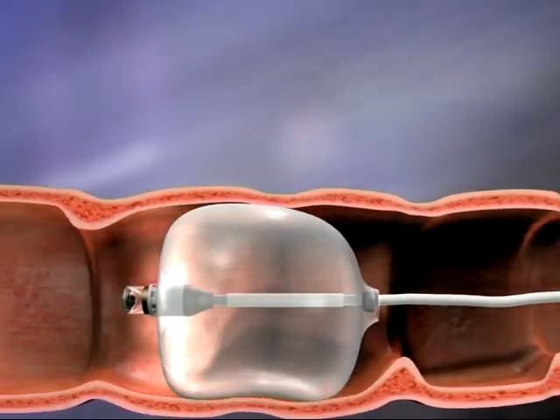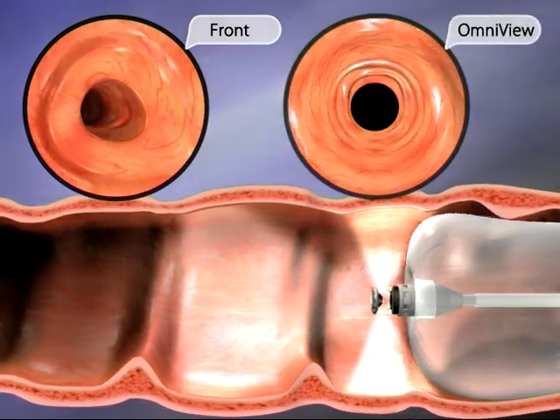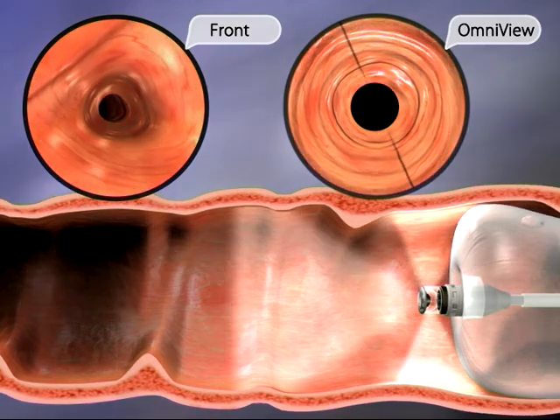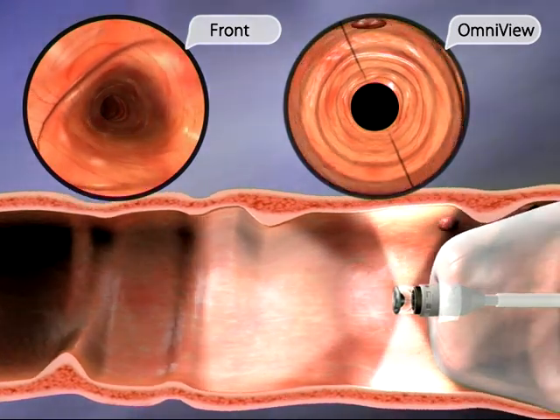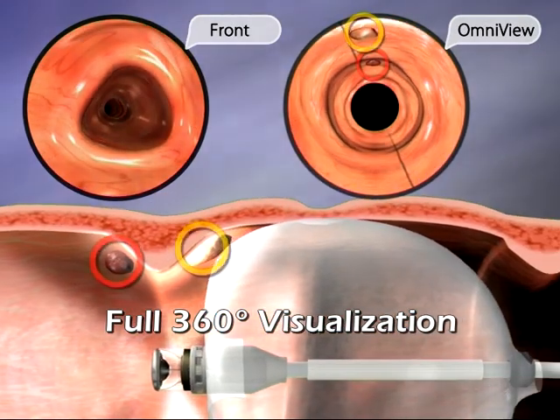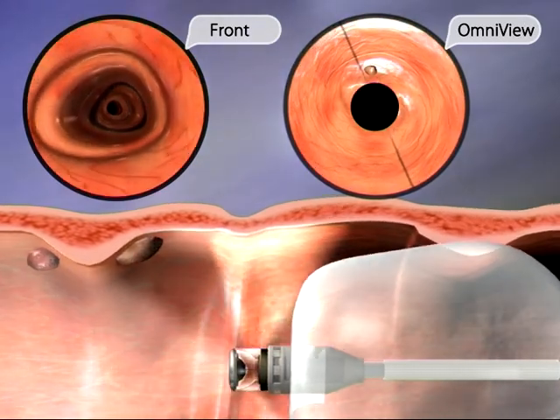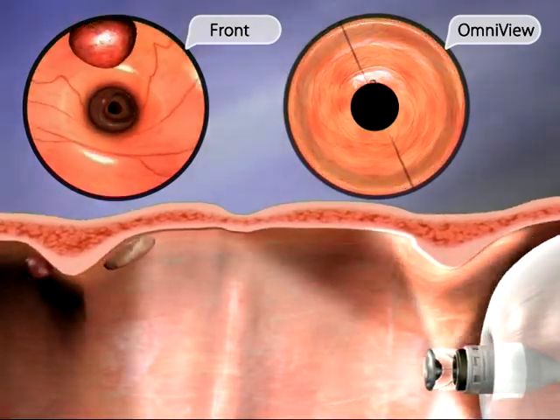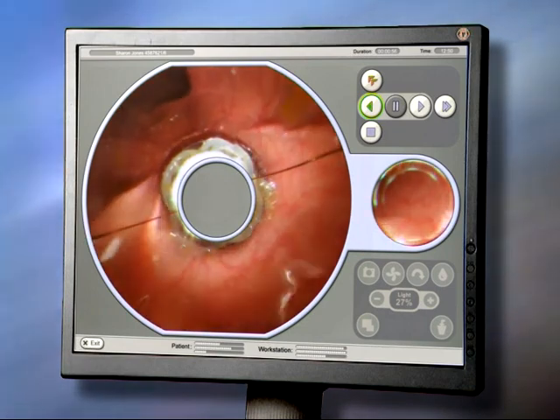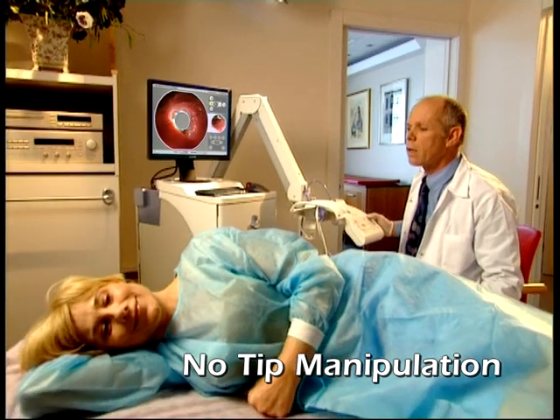Aeroscope's advanced vision system provides two simultaneous views for comprehensive visualization of the colon: a 90-degree forward-looking lens and a proprietary Omniview camera, which provides simultaneous 360-degree viewing of the mucosal surface ahead of the capsule, behind it, and to all sides. This unique approach brings more of the mucosal surface into view and helps avoid the need for continuous tip manipulation.